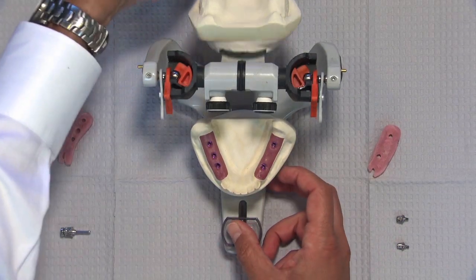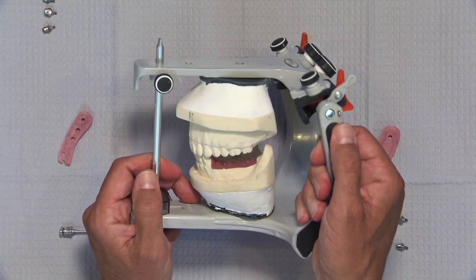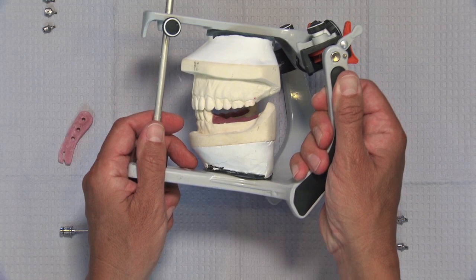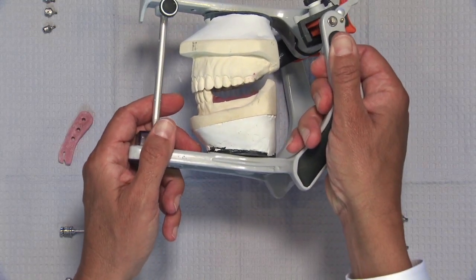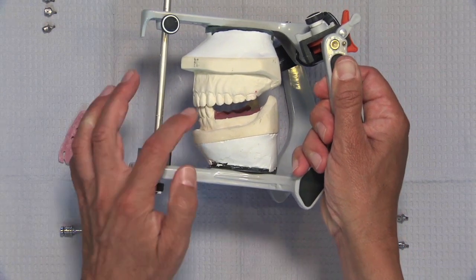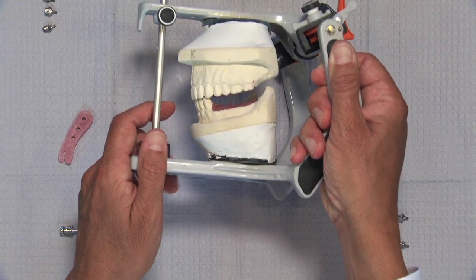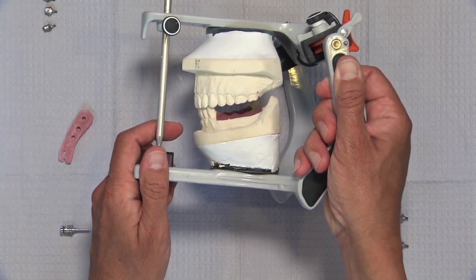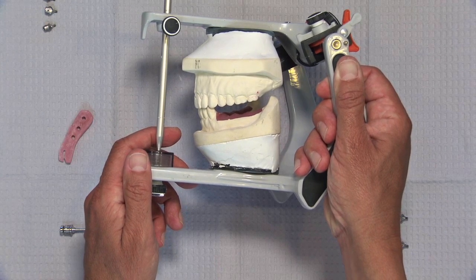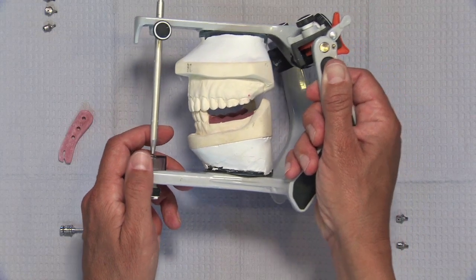And in both of these cases, and this is true for regular crown and bridge cases, but certainly for the implant cases as we look at this, you can see we just have a lack of posterior support because we're missing all of the posterior teeth. When it comes time to take a bite registration, some dentists will just inject material between the remaining anterior teeth. Some dentists will inject material back here onto the edentulous ridge and against the teeth. Either way, we end up with a much higher remake rate than we should because we really don't have a good way to take a nice, stable bite registration.